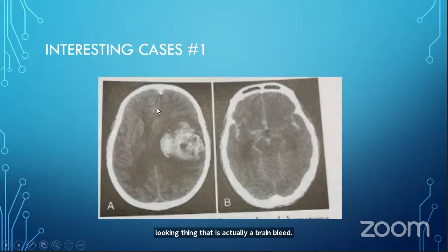And it's causing the brain's midline to shift. So you can see here, this midline shift. Over here on picture B, you can see a severe subarachnoid hemorrhage outlining all of the cisterns of the skull base. So all of these light parts that you're seeing are abnormal.